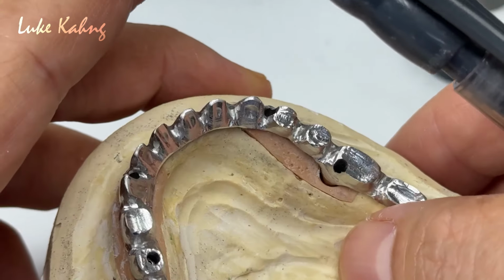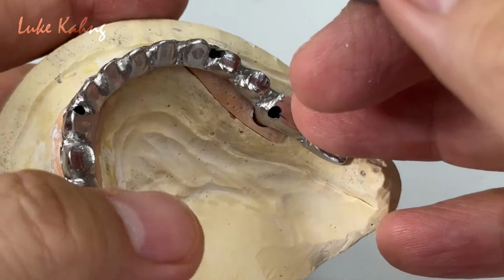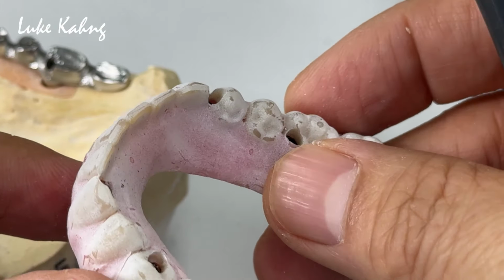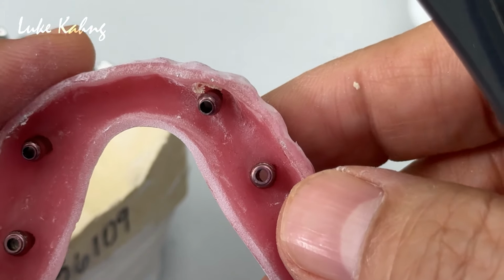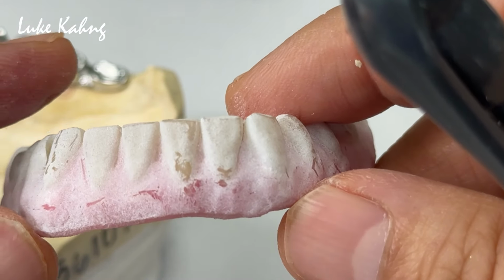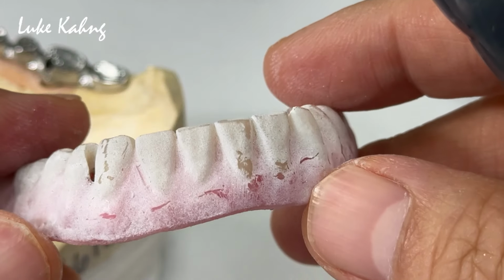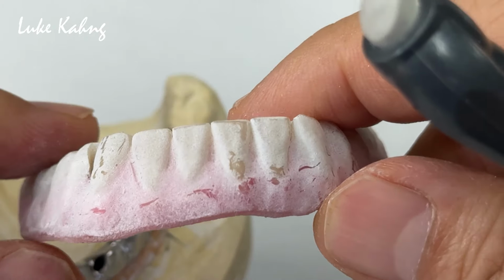I'm going to make the 6 unit monolithic anteriors, 4 unit here too. And I'm trying to decrease the tissue contour from the wax try-in. This wax try-in is most likely a problem, and they were always working, because wax has to make the block, wax block, and then we stick together, and then they create it. Once they get it, either they're not going to be happy, so back and forth regarding the wax reset. And even though they're happy, they will get bulky with the zirconia.